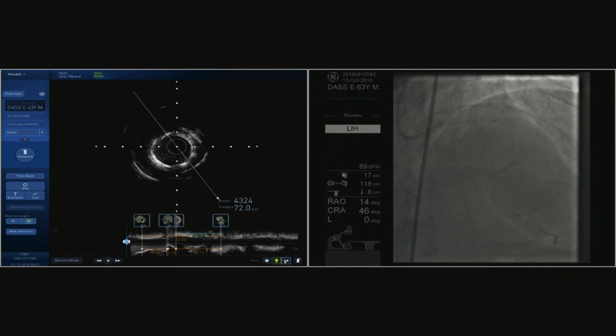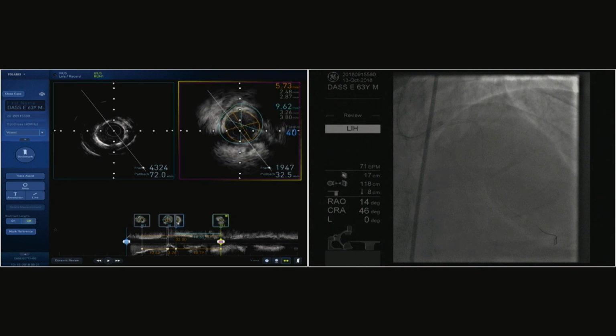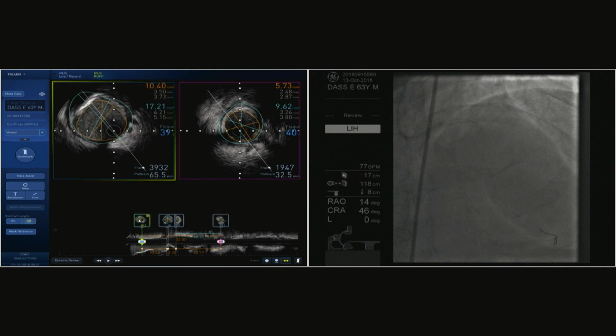So Dr. Hirahata, would you agree that we should use 2 stents rather than 1 to cover this lesion? Yeah, actually, this is a very long region, and the distal reference segment is about 2.5 millimeter, so it's going to be too small for the maximum dilatable diameter for the left main stenting. So I would like to say that 2 stents is better for this case. Great. So 3.5, 2.5 and 3.5? 3.5, 15 should be a good start, or 18. Give me an 18. Yeah, 18.